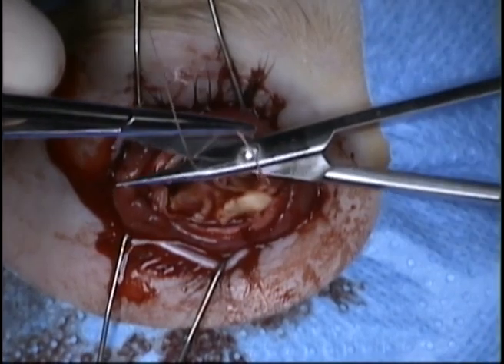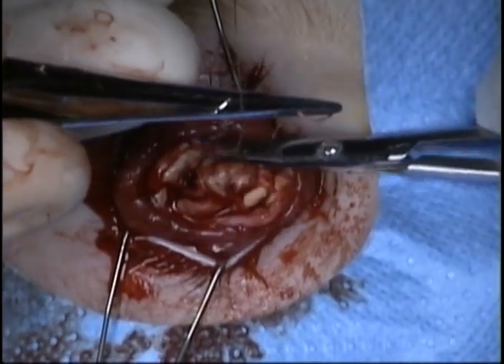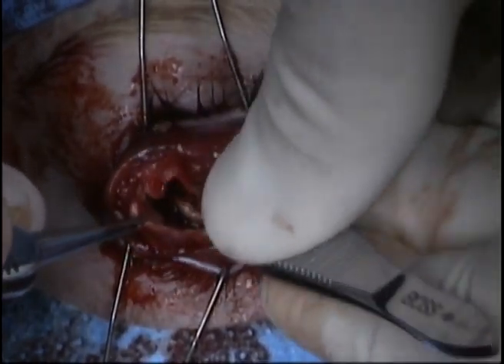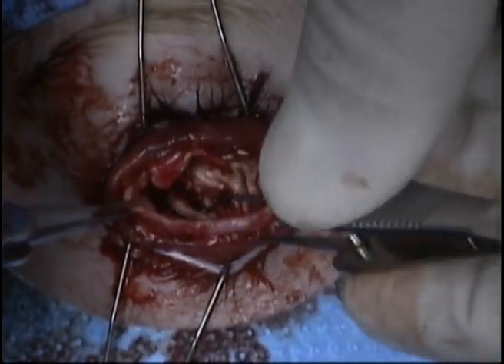The posterior sclera is then closed over the implant with interrupted 4-0 Vicryl sutures. The anterior sclera is then closed by imbricating the sclera over itself.